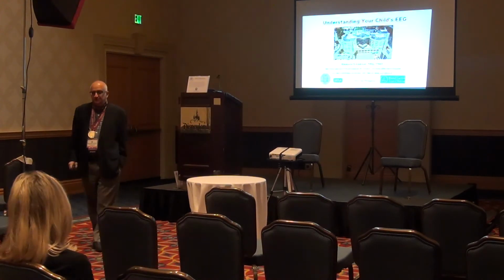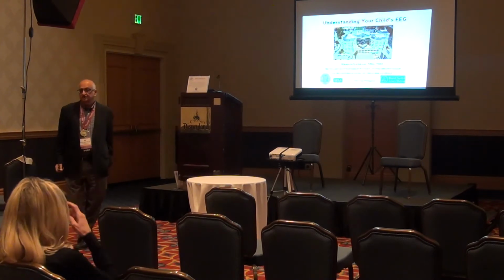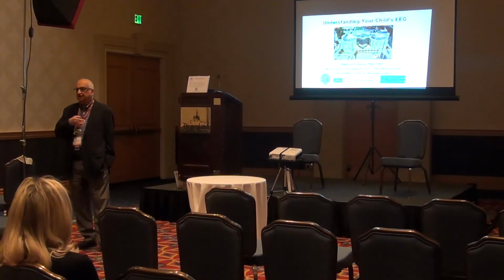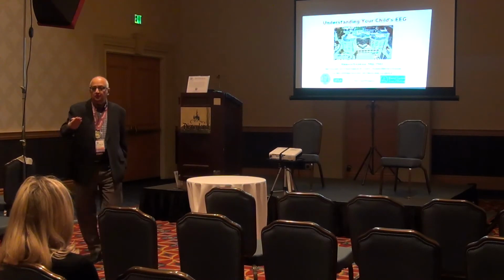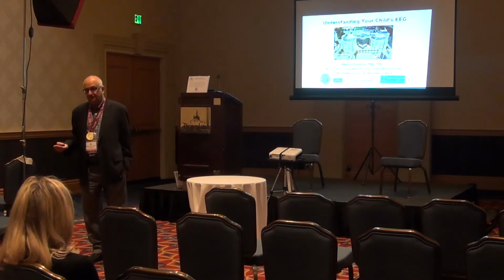Yeah. All right, so the topic, as you know, for this session is understanding your child's EEG. What I'm going to show you has a lot of technical things, but you don't have to. I just want to give you a flavor of what we do with it and what kind of information we can get from it. And it's equally important to know what we cannot get from it, right?